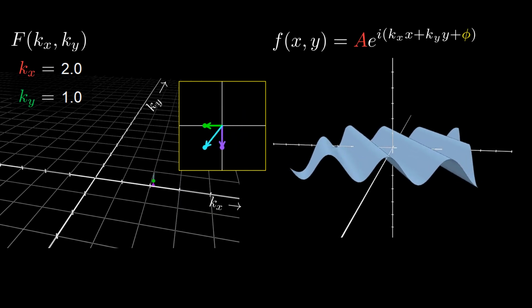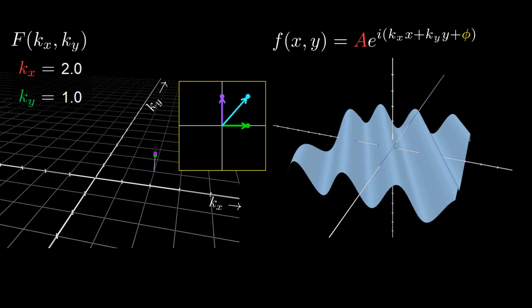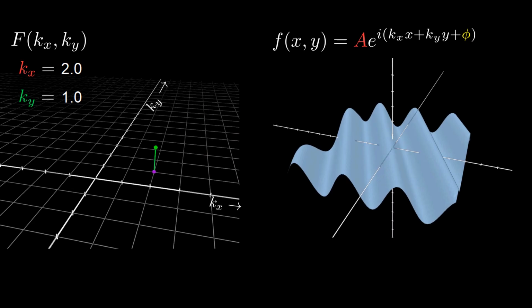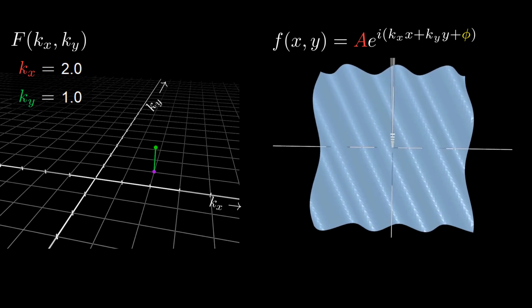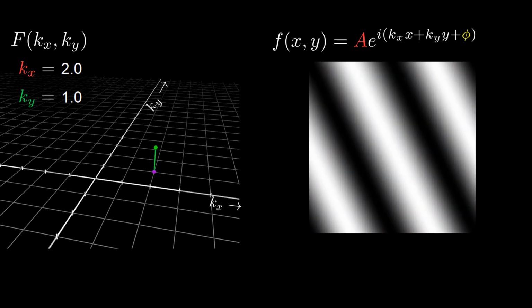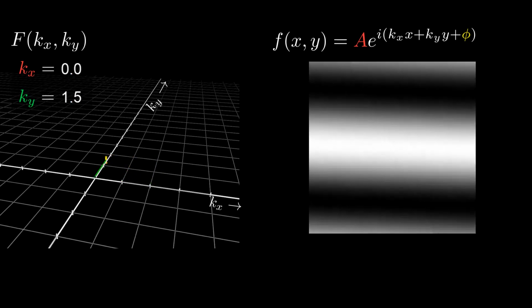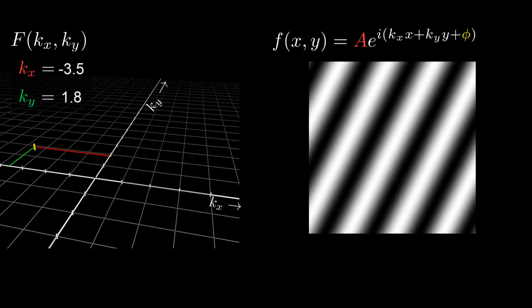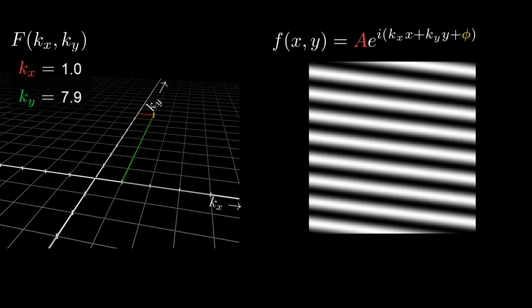Now let's put this in the context of images. Images are indeed 2D functions of space, f of xy. So instead of visualizing them as these 3D mesh functions, we'll view them as 2D functions of brightness. Large values of f are colored white, low values colored black, a standard linear grayscale. Here's the same animation showing our walk around kSpace and corresponding spatial frequency at each kSpace location.